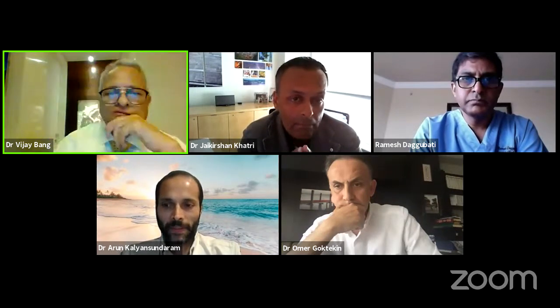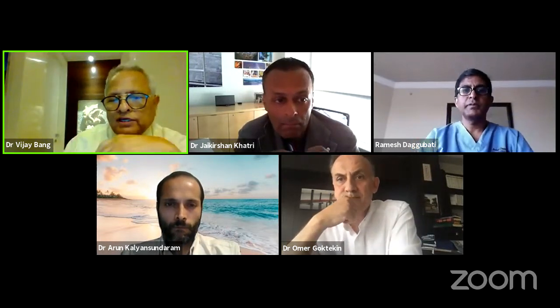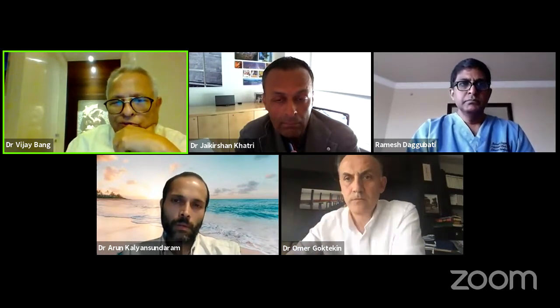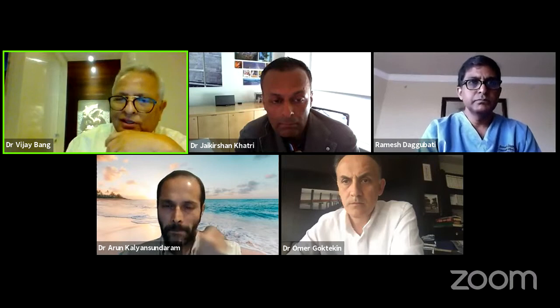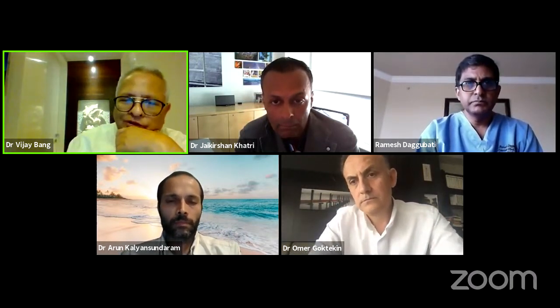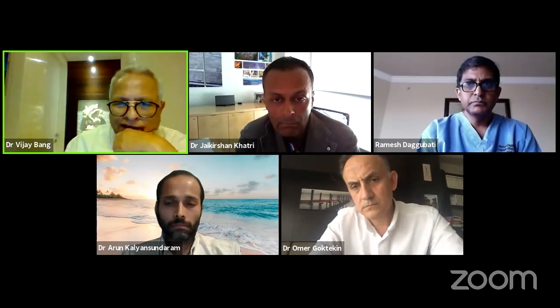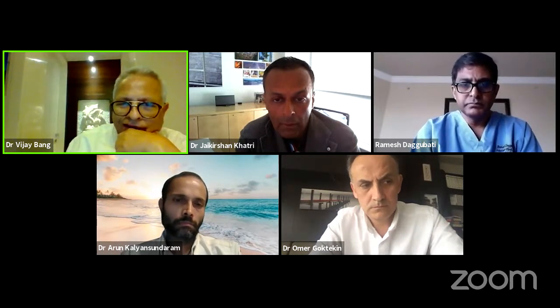Yeah, very good. And when you want to select a wire or a microcatheter, for that matter, for any given CTO case, what do you like to see, and how do you decide? As we discussed, for the proximal cap escalation with the wire, we usually prefer a low tip load wire with the polymer jacketed wires. So any other way of thinking?